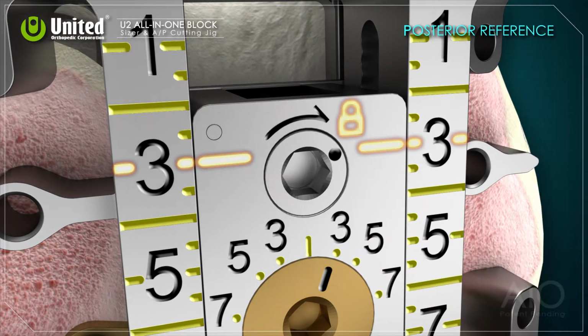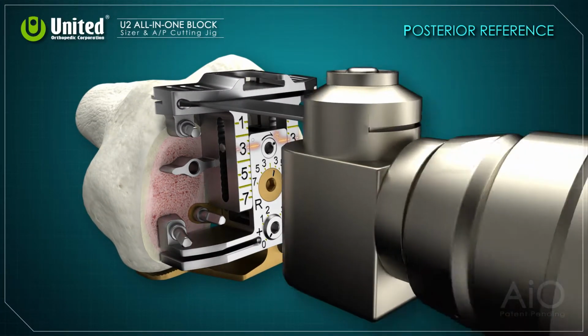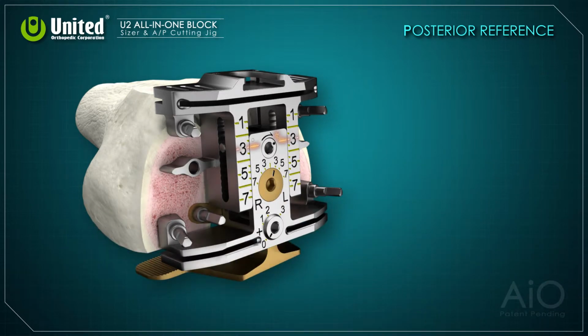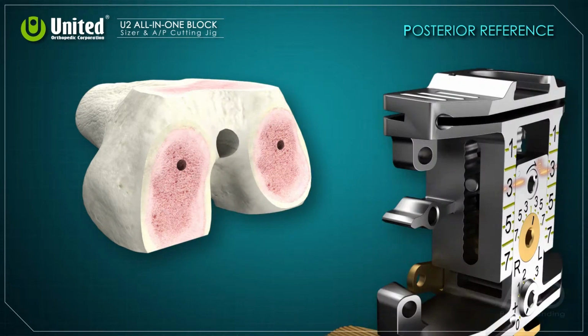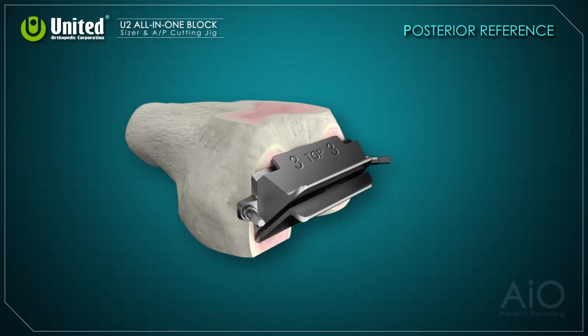Lock in the chosen size by rotating the upper knob. Fix the anterior and posterior slots before making cuts by using a 1.27 mm saw blade. Drill 2 reference holes to align the chamfer cutting jig. And perform the chamfer cut.